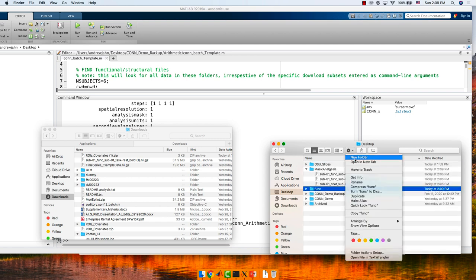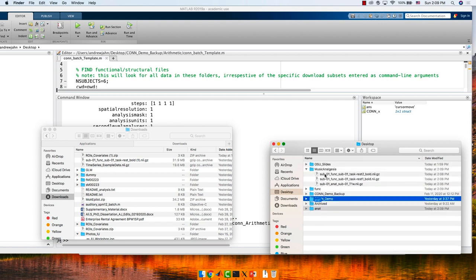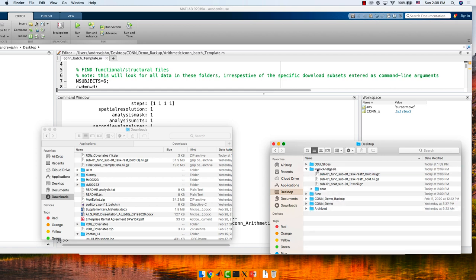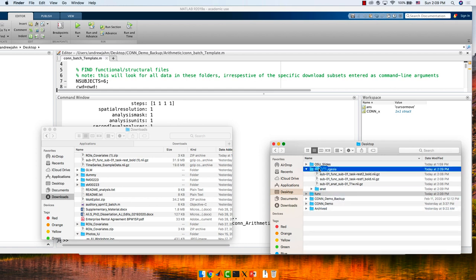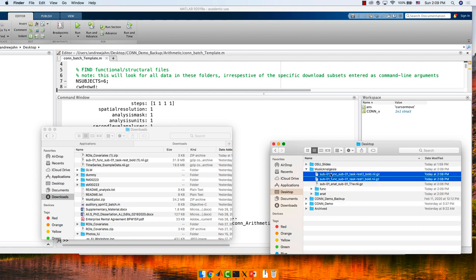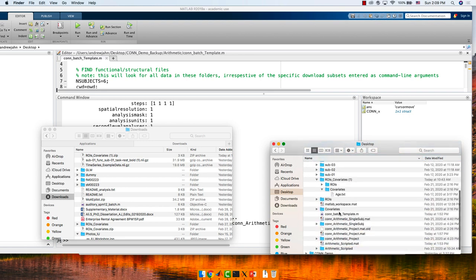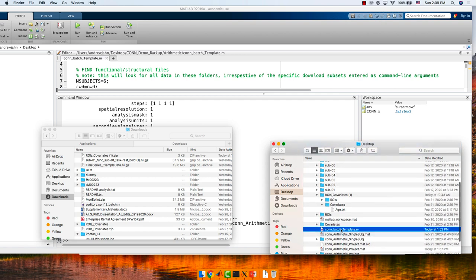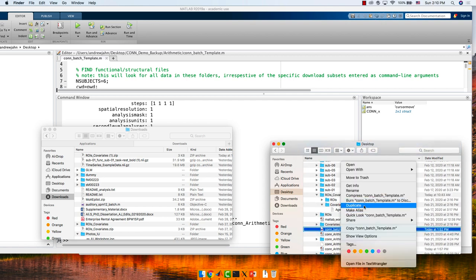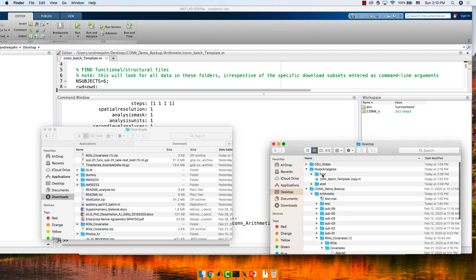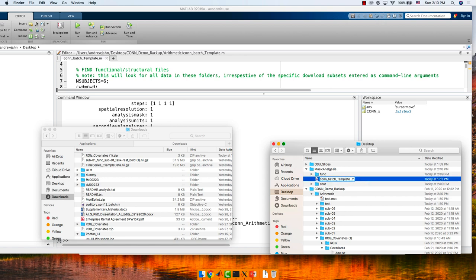I'm making a func folder and an anat folder. I'm moving the bold data into func and the anatomical data into anat. While I'm here, if you have that CONN batch template script, create a copy of it, move it into this directory, and rename it con_batch_template. I just want to see if it works — I talked a big game about how it's transferable, so let's actually see if that's true.